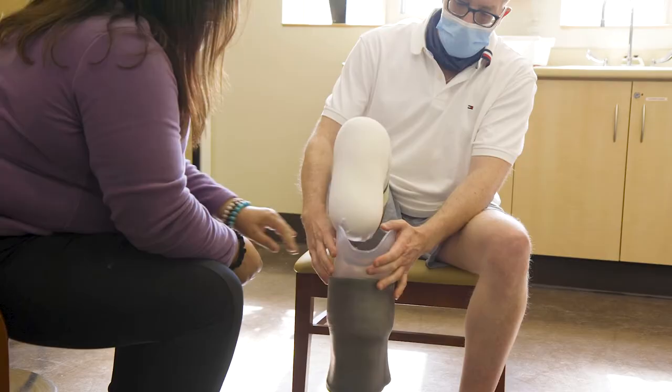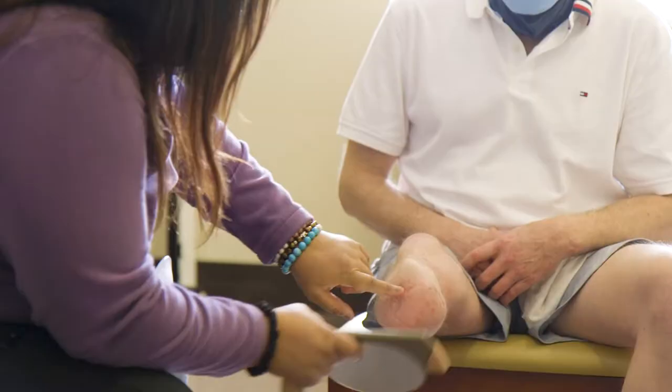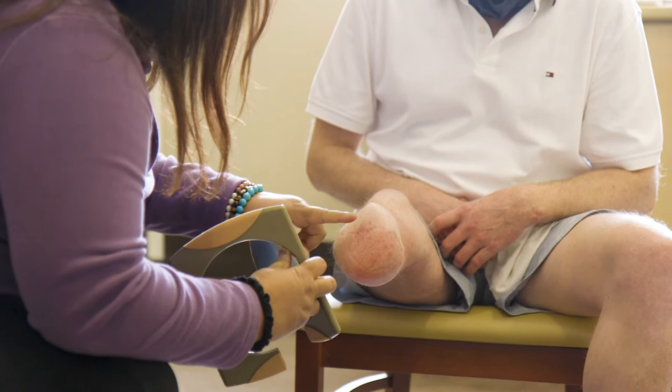Check for signs of a good fit. When the prosthesis fits you properly, you will feel light contact on the end of your residual leg. Check your skin. Use a hand mirror to make sure there is no new redness, bruising, or broken skin.